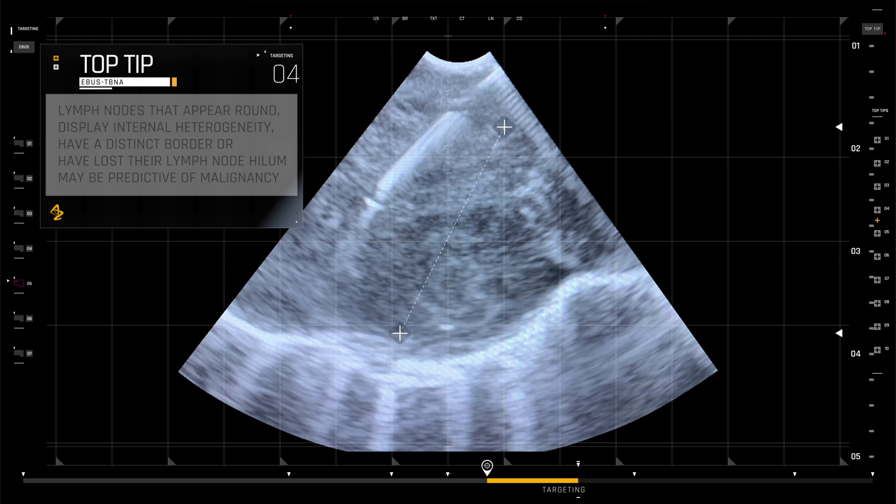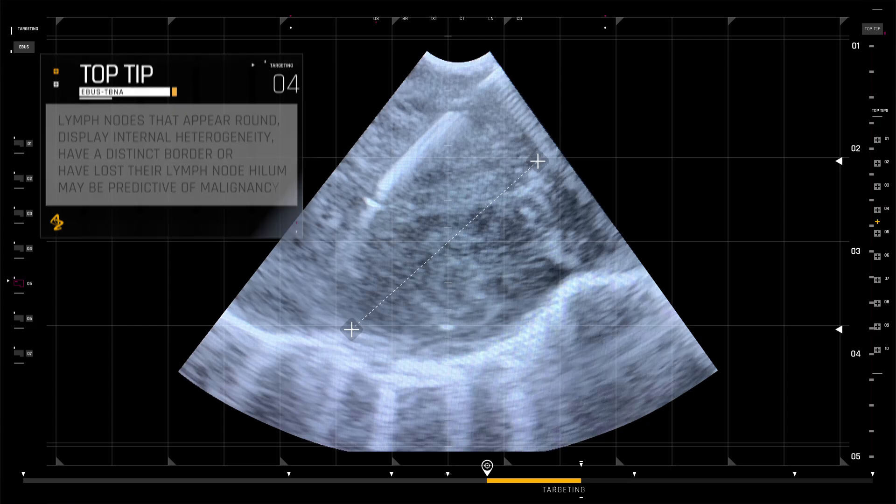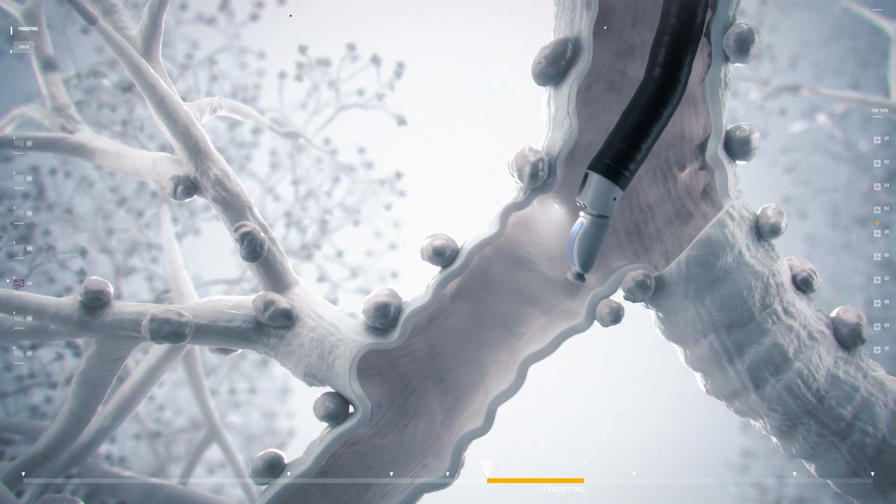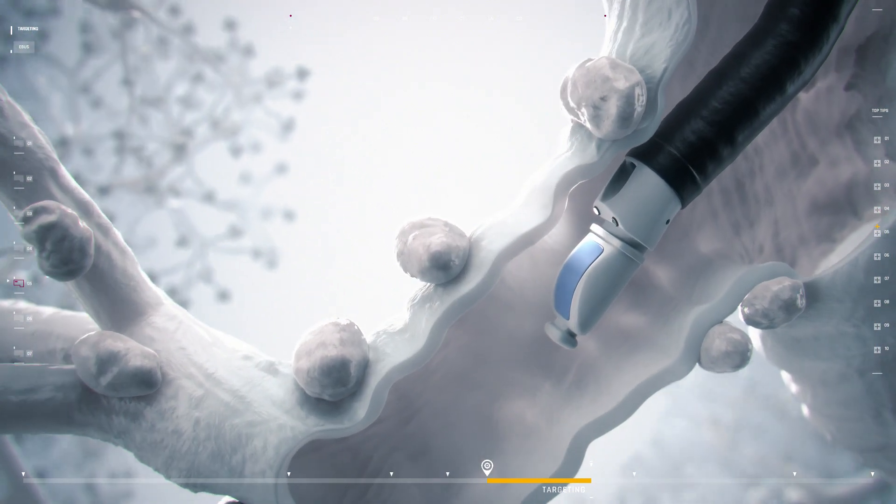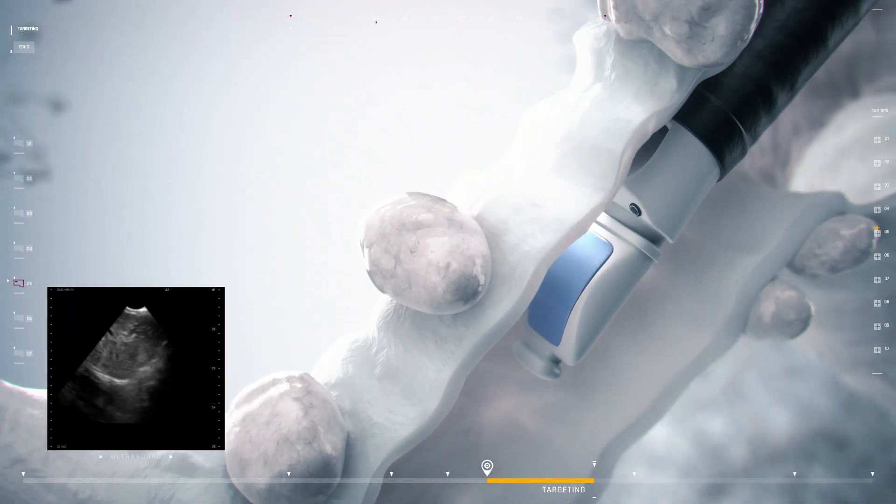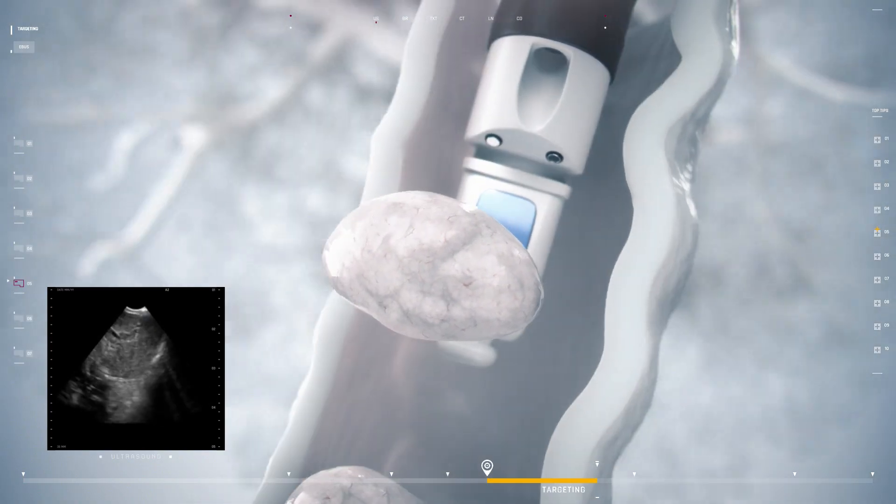To avoid unintentional puncture of vessels between the wall of the bronchi and the lesion, use the ultrasound scan to identify more echoic areas, which are likely to be lymph nodes rather than blood vessels.